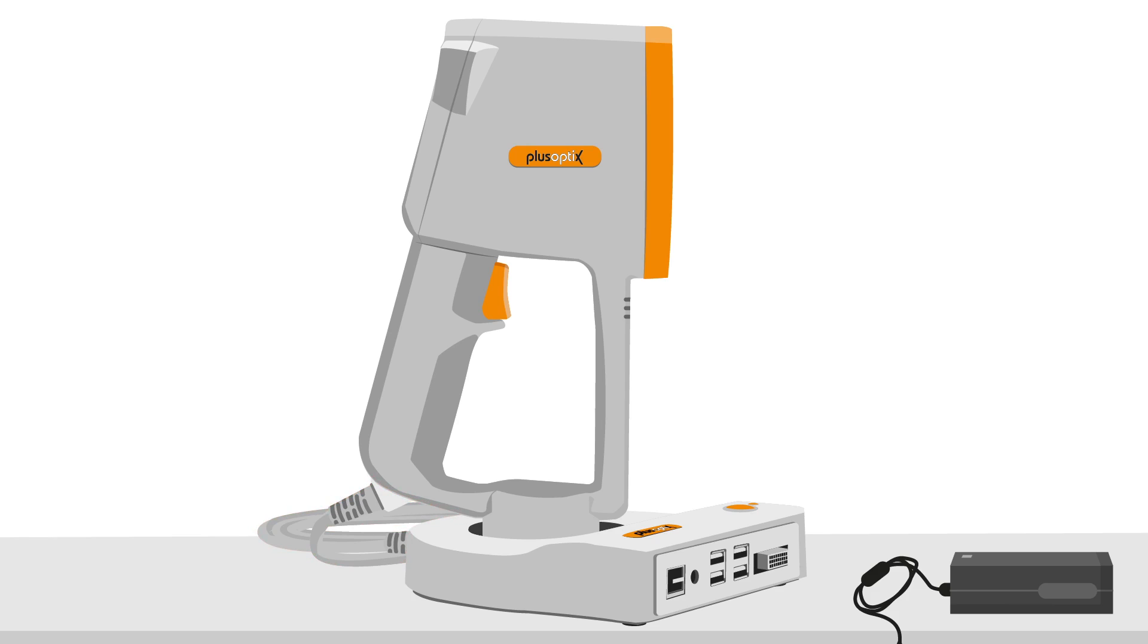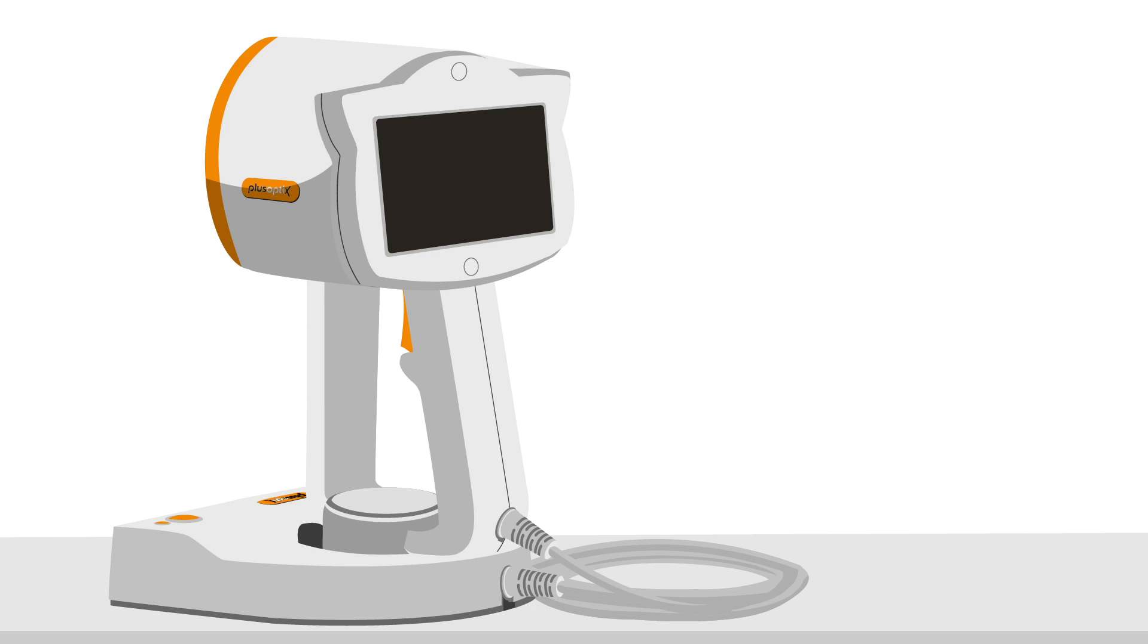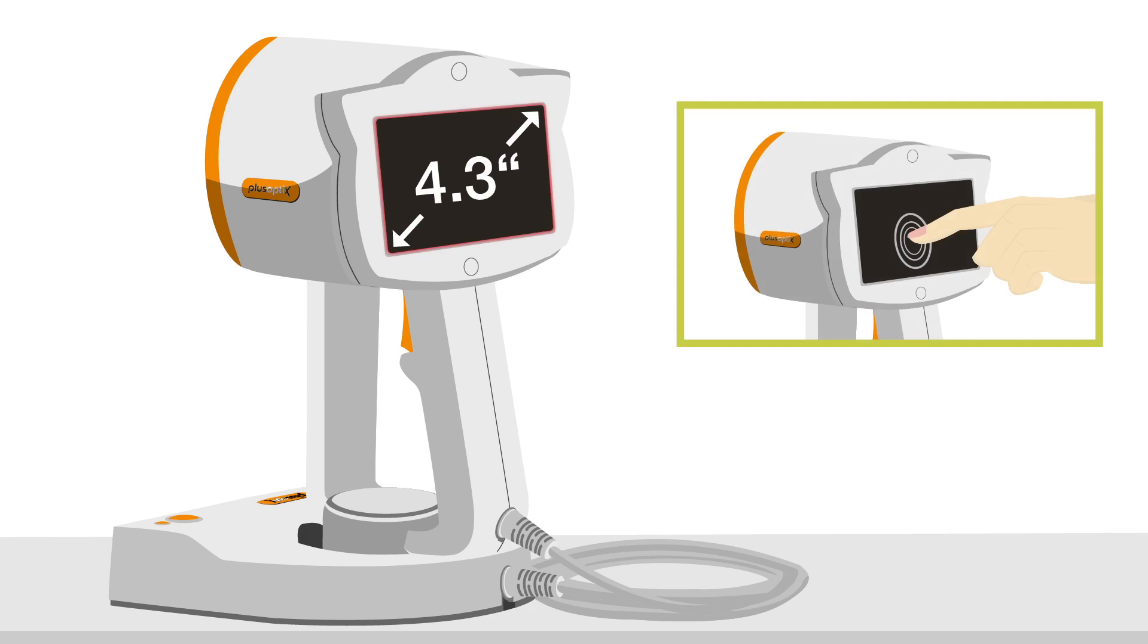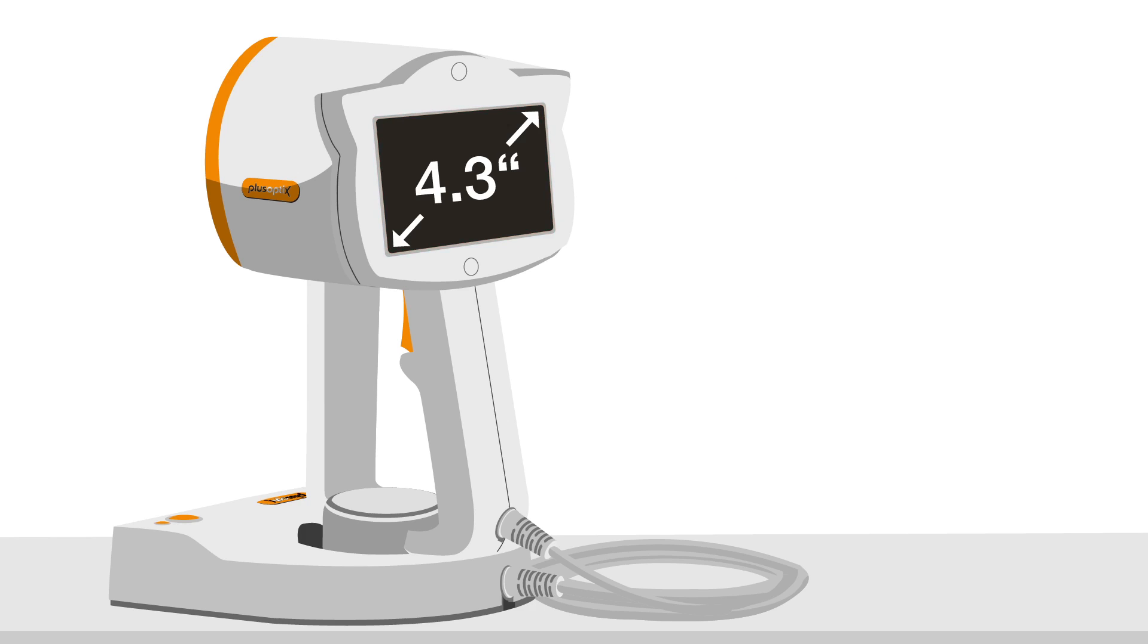Let's have a look at the back side. The screen is a 4.3 inch resistive screen. Resistive means it will respond to the pressure of your fingernail or the blunt tip of a pen touching the screen.